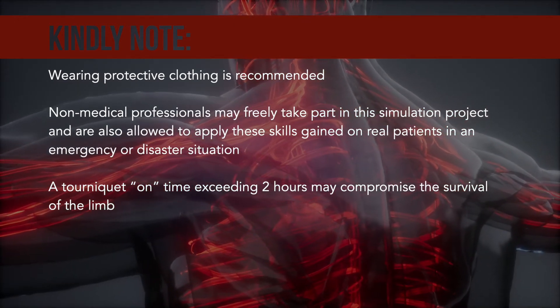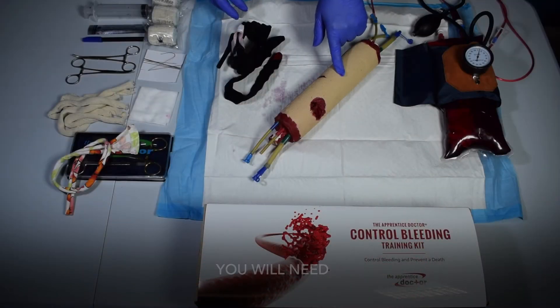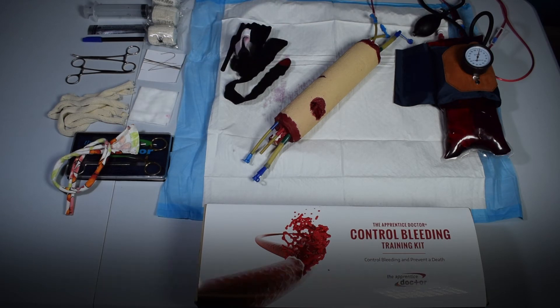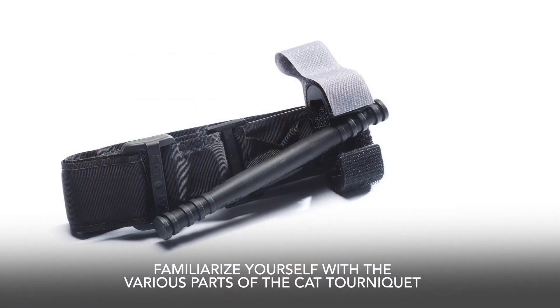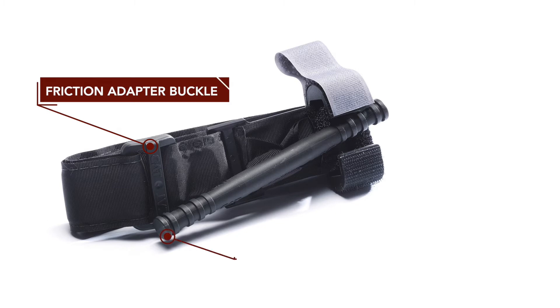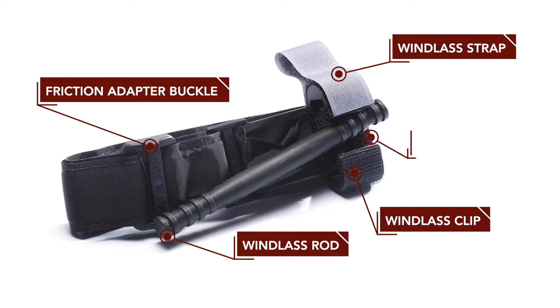A tourniquet on time exceeding two hours may compromise the survival of the limb. You will need the control bleeding simulation arm and the Combat Application Tourniquet, or CAT tourniquet. Familiarize yourself with its various parts: the friction adapter buckle, the windlass rod, the windlass clip, the windlass strap, and the omni tape band.